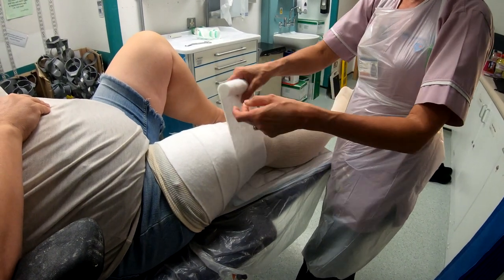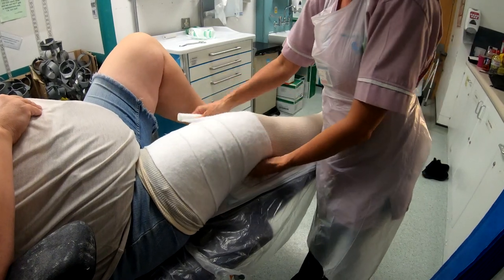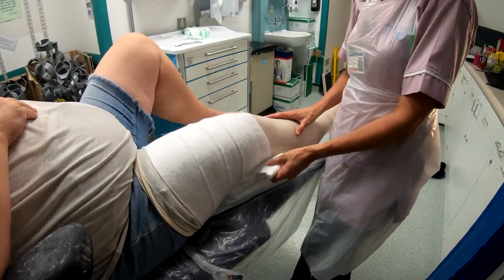I did forget to mention that before you put the sock on, do check the whole area of the leg underneath, making sure there are no exposed wounds, because you never know. And if there's a wound, you need to have that covered and dressed before you put the cast on.